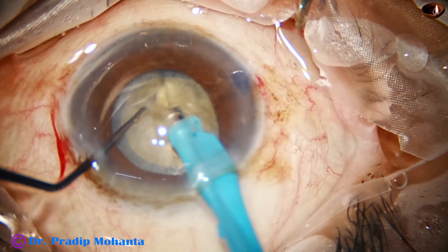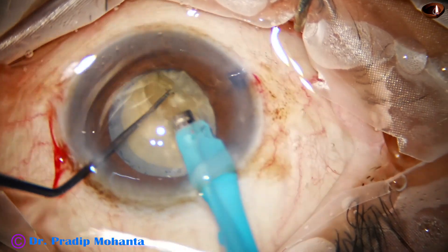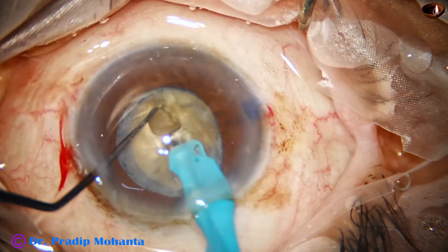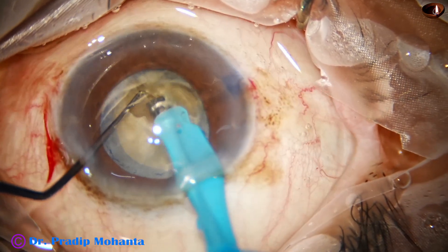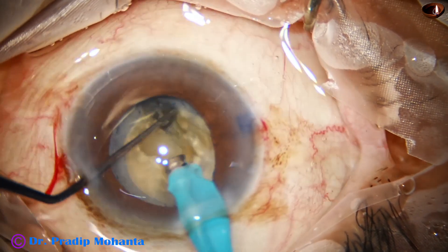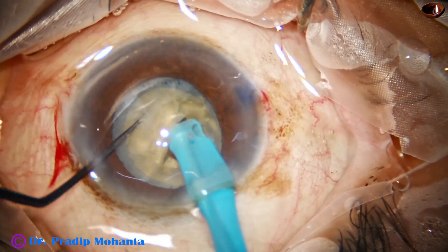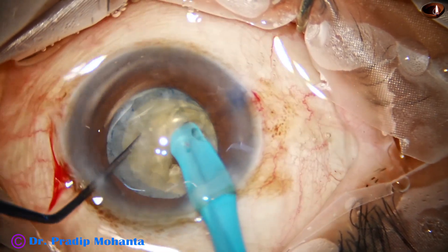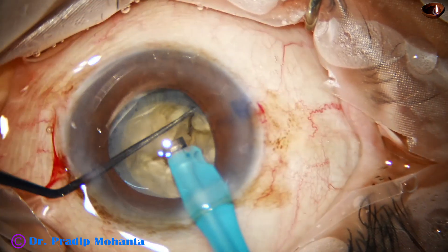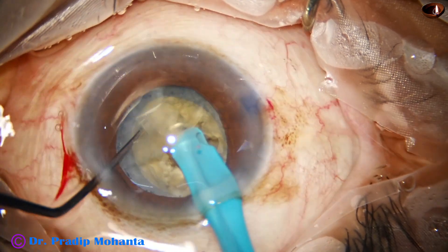We have got a very nice crack. Coming to the other side, we make a deep sculpt and then turn the handpiece to hold one hemi-nucleus and separate the other one. We have got two free hemi-nuclei, and now the handpiece goes through one hemi-nucleus and we have been able to crack it into two pieces.